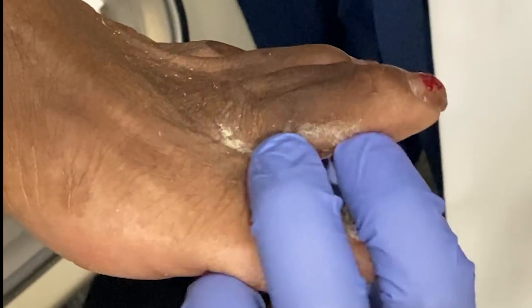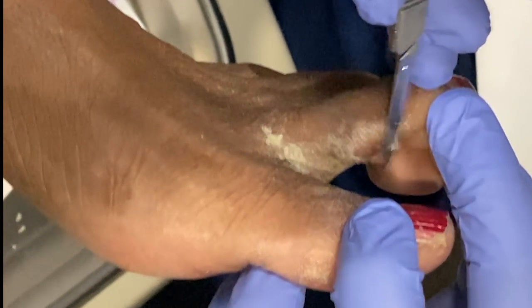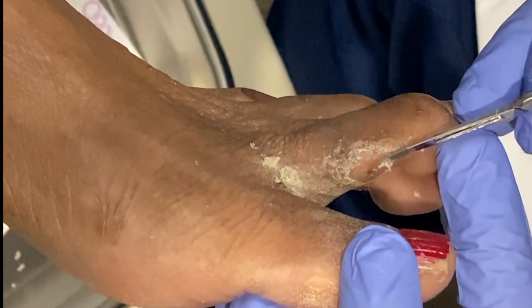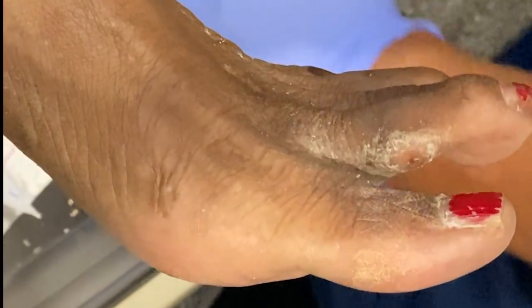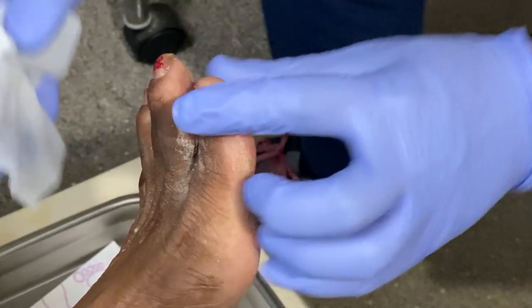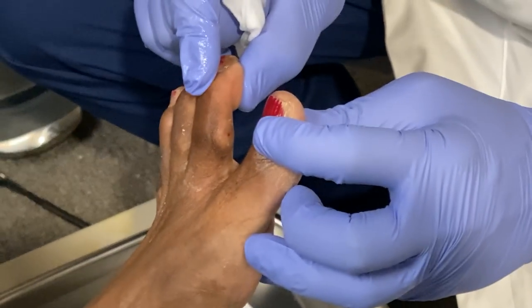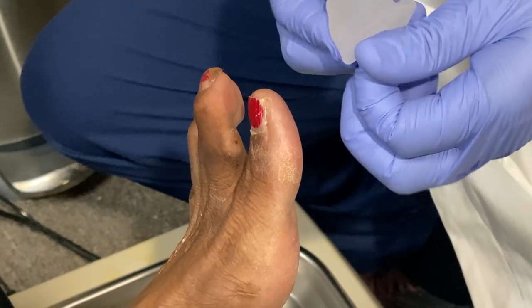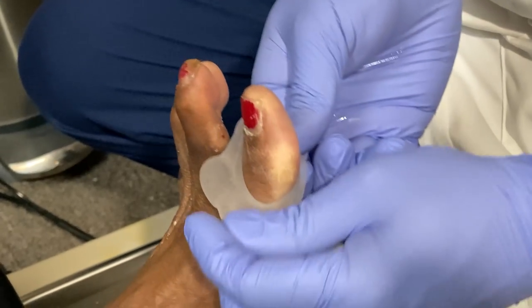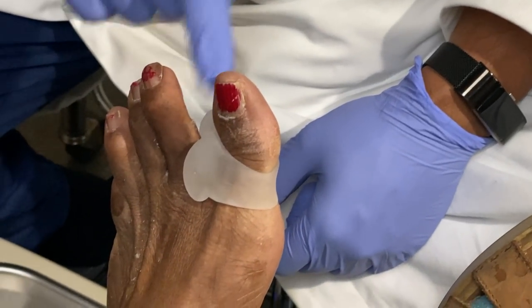This is something I will probably need to eventually do a surgical procedure on, which is essentially shaving down the bone. That will give her long-term relief. But in the meantime, the best thing to do is keep those two toes separated. We actually have a nice little silicone toe separator, which many of you have probably seen in stores. They do work very well, and you'll see me put one on here. I like the one we provide in our office from Petafix, which essentially has a ring to it that allows it to stay in place. She'll wear this in her shoes, and whenever she's ready for surgery, we will take care of her.